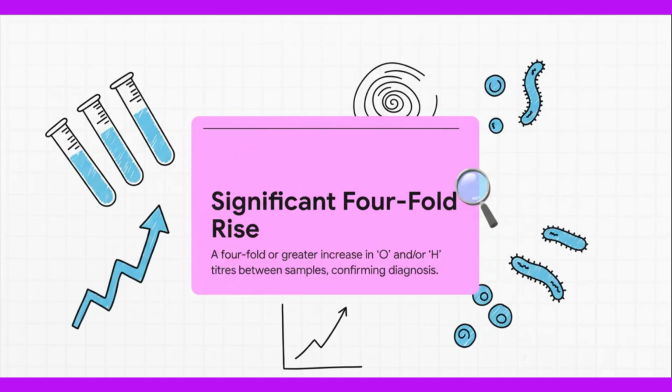And this brings us to a really crucial definition, a significant fourfold rise. What this means is that the titer in the second sample is at least 4 times higher than in the first one. So for example, it goes from 1 in 80 all the way up to 1 in 320. Seeing that change is what serologically confirms the diagnosis of enteric fever.